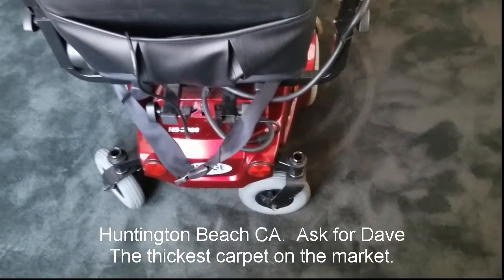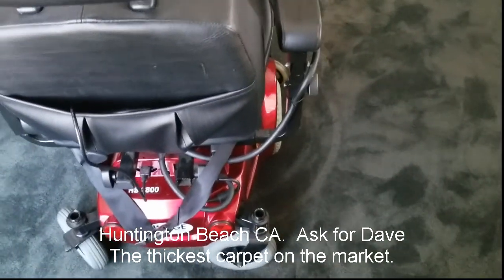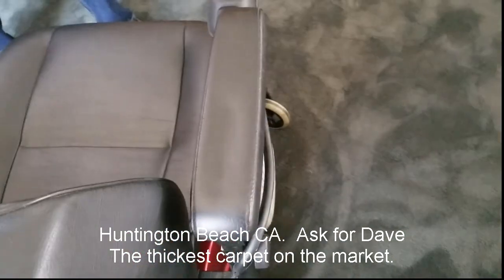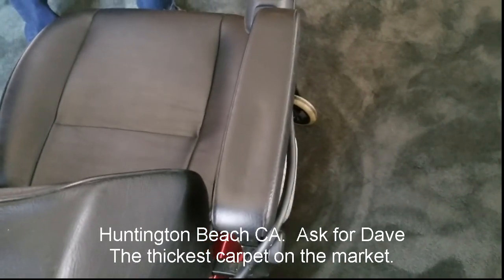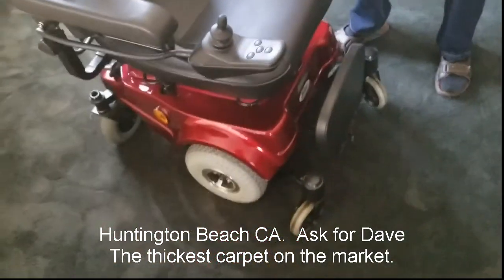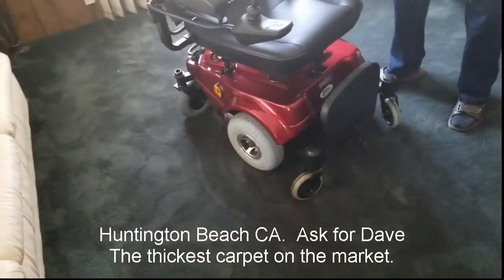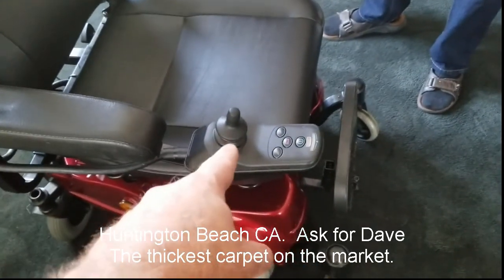She was using it, when she was alive, on a very thick carpet — a carpet that's very hard to get around on for chairs. But this chair has a maximum speed capacity of three miles per hour. These chairs don't go much faster than that, although we have another one that does.